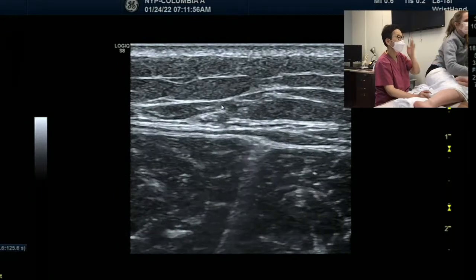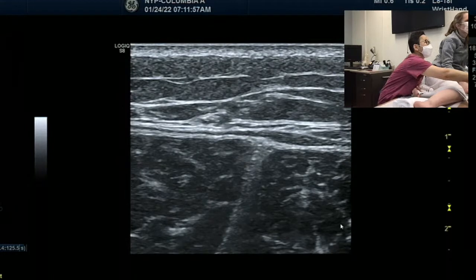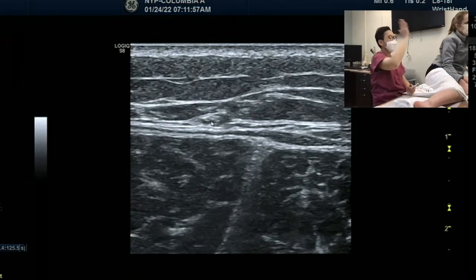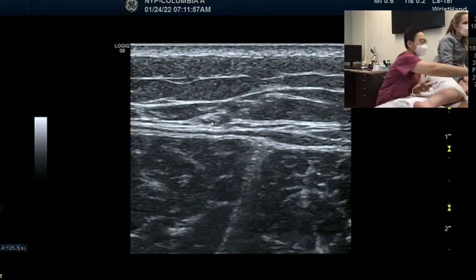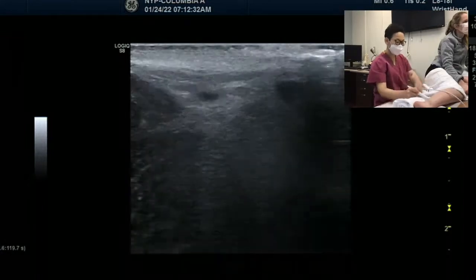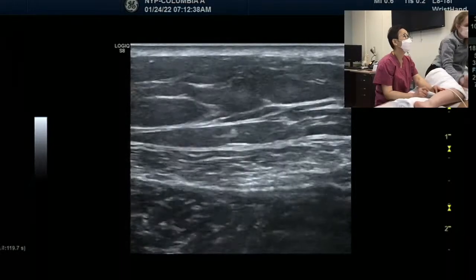Can you stop here? Freeze. So if you look at it, this is not deep, but I'm gonna show you with the cursor. This is the medial gastrocnemius. This is the lateral gastrocnemius. This is the sural nerve. Last time we found that where the two heads meet, on top of the two heads, the sural nerve starts to split into medial and lateral. So we should see two dots. It was very hard the last time. But let's see. Medially is the tibial contribution and laterally is the peroneal communicating branch.